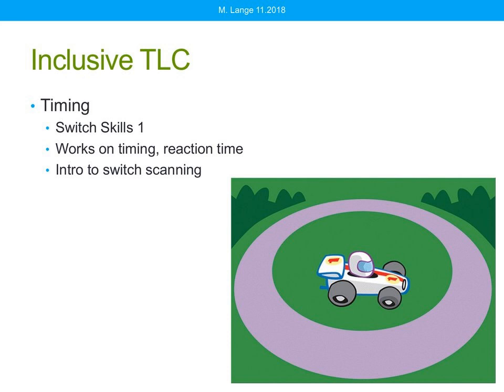This is the appropriate time to hit my switch, and I need to do so in a relatively appropriate window of time. So I'm working on that reaction time as well. There's a variety of activities because with children, hey, with adults too, it's very important to keep that motivation going. So we want to provide a variety of activities so we know that the client is still engaged.